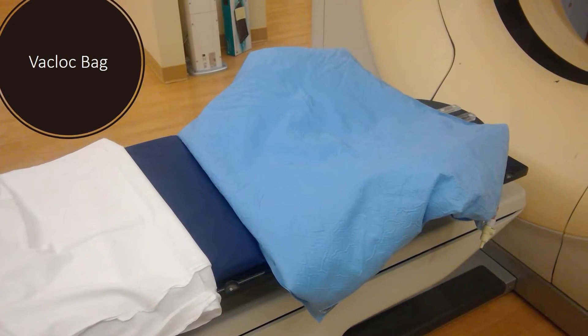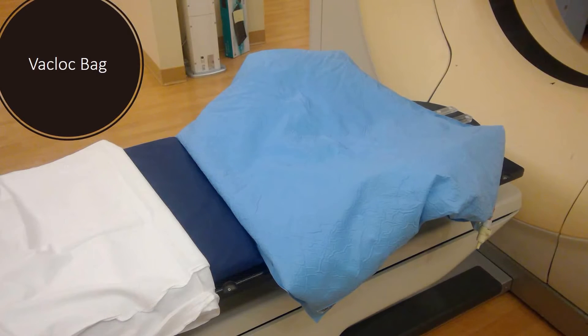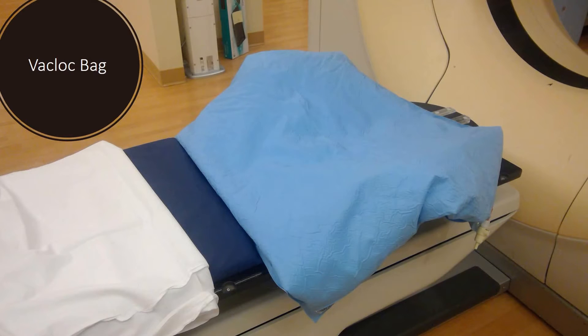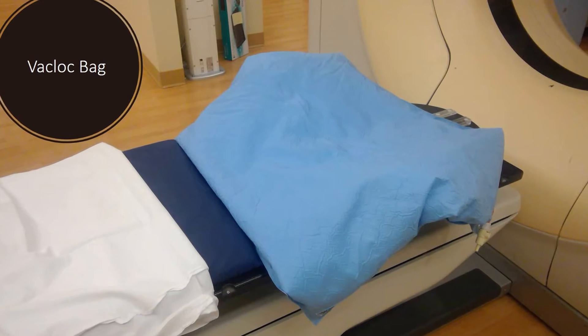This is a vac lock bag. It's used to stabilize your upper torso as well as support your arms, as they will be resting above your head. This bag is full of beans and the therapist will form it around your arms to your comfort. Once an acceptable position is found, the air gets sucked out and it forms to your body. This immobilization device is specifically for you and will be used every day during your treatments.